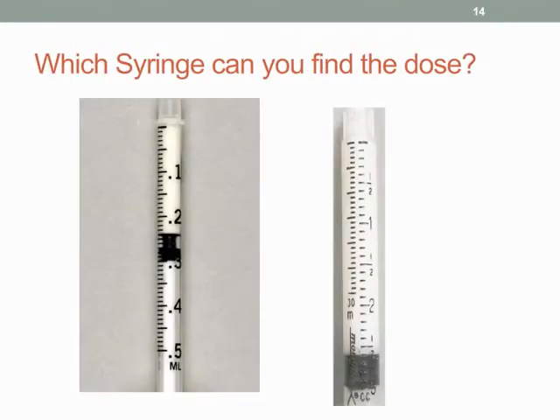I wanted to go ahead and give you an example of two syringes. And you see here that if you use a regular syringe, more than 1 ml, this is a 3 ml syringe, the closest I can get is about at 0.3. I can't get our answer of 0.31. Whereas in the second syringe, you can see that I can actually get 0.3, and then this arrow is up a little high. I would move it down just a bit to get it at 0.31.